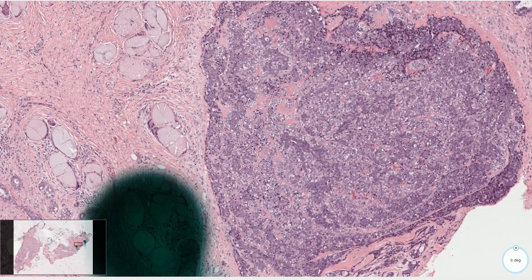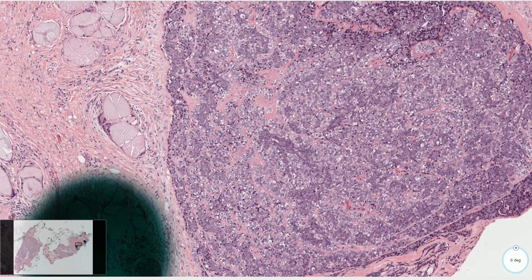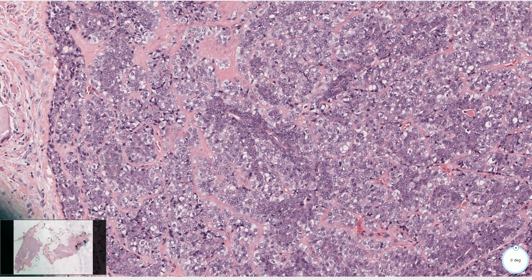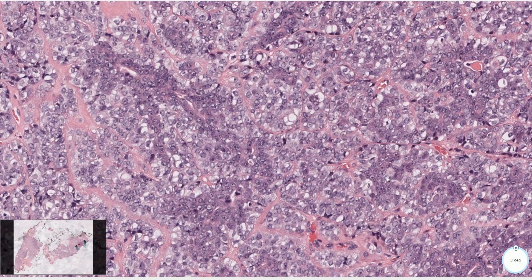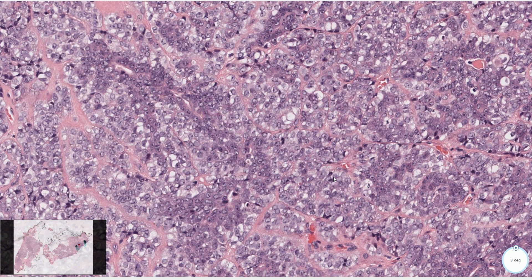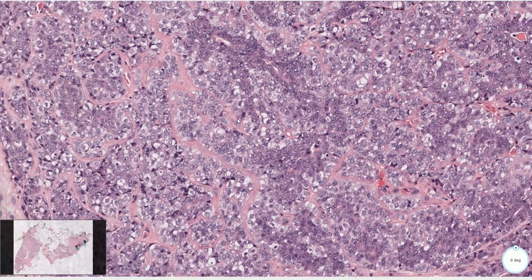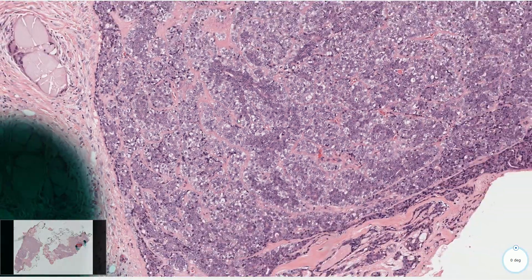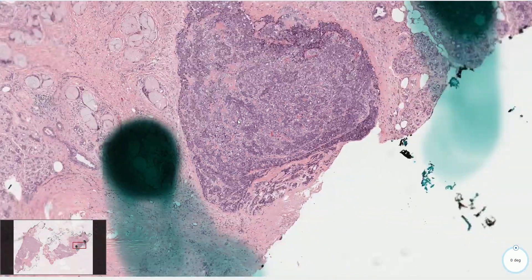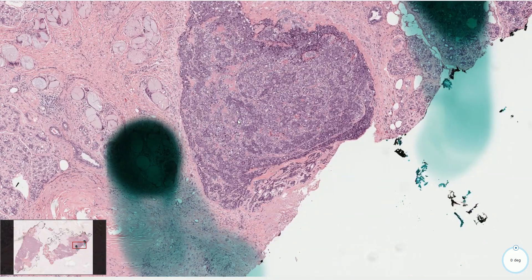Zooming in, we can still appreciate the darker epithelial cells and the lighter myoepithelial cells, but the nuclei are bigger, they have prominent nucleoli, and there are numerous mitotic figures — four mitotic figures visible in this field. This represents a malignant component within an otherwise benign adenomyoepithelioma.